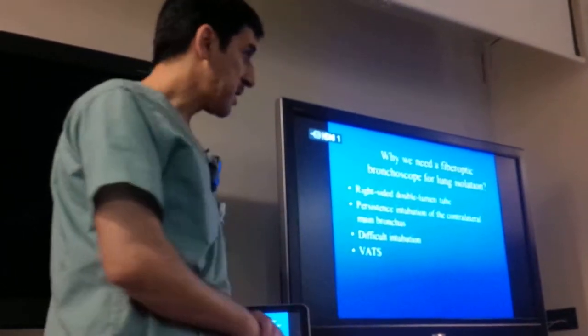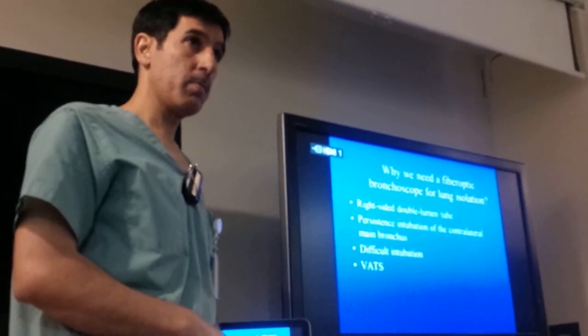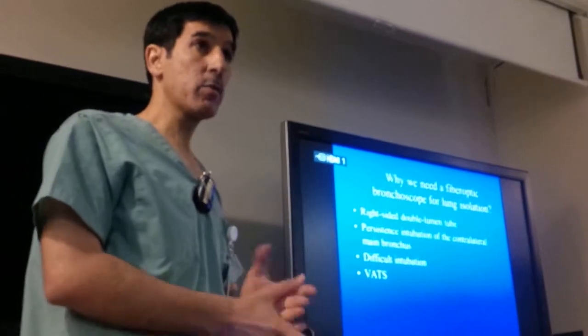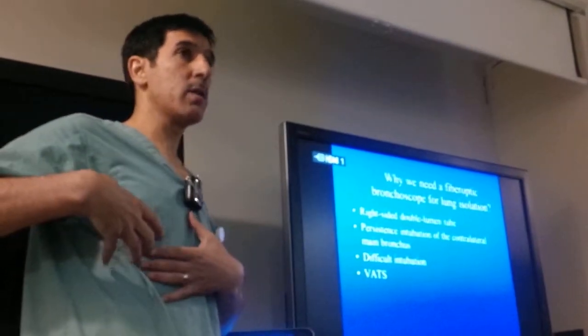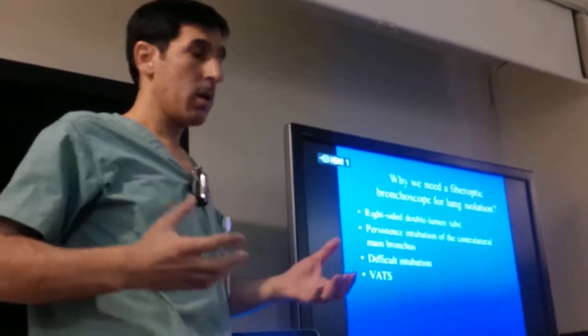Now 65 to 70% of our procedures are thoracoscopy. Here you don't have a choice. You have to isolate the lung. You have to get a good isolation. Otherwise the surgeons will not have exposure. He will not see anything.